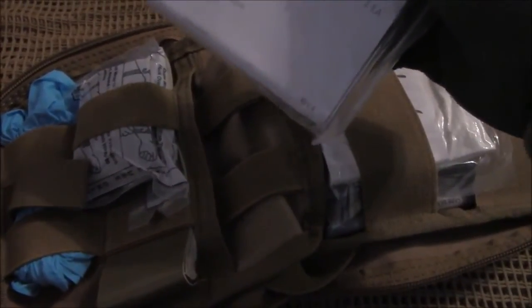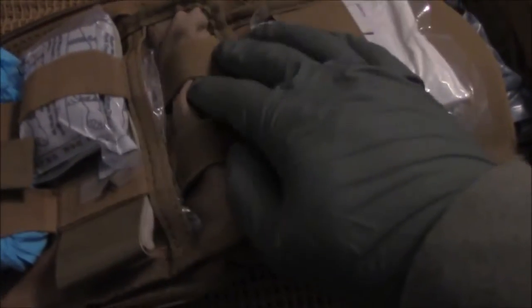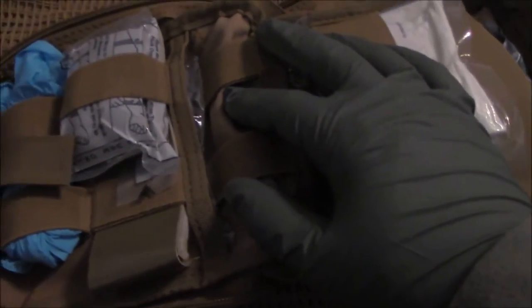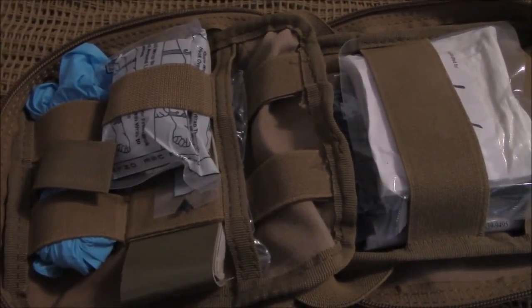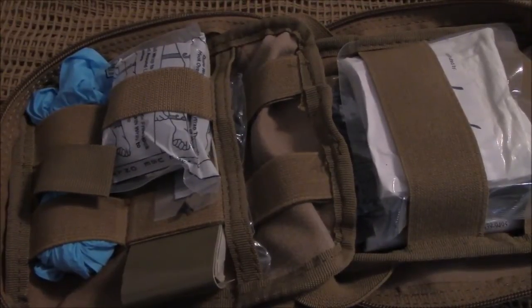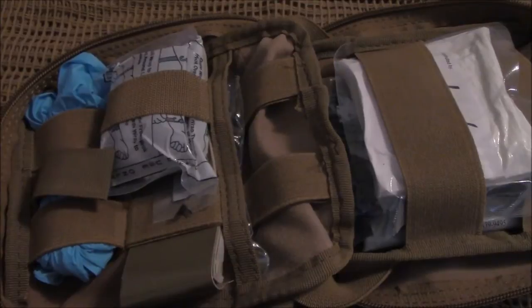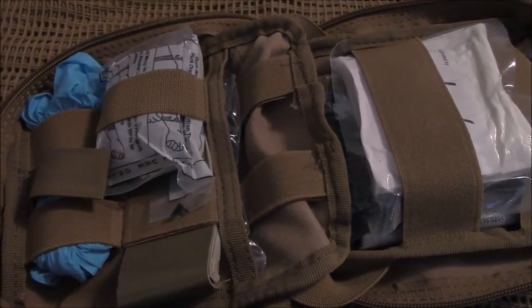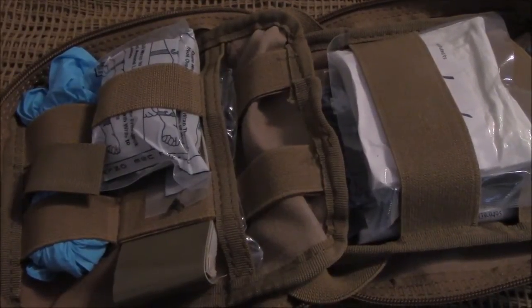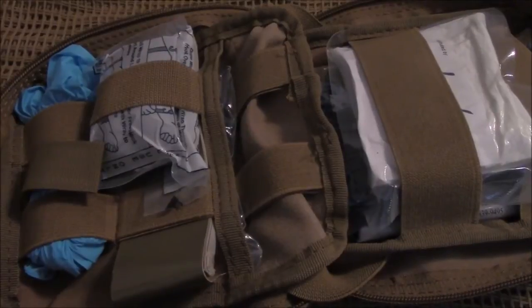And here is the emergency blanket right in here. There's plenty of room to put even more stuff in there. Things you might want to add include various sizes of adhesive bandages. Also, once you get a little bit more training in trauma medicine, a decompression needle, an oral airway or a nasopharyngeal airway — an NPA.